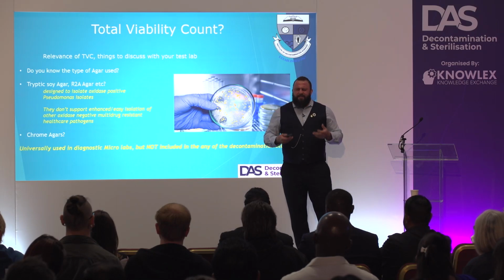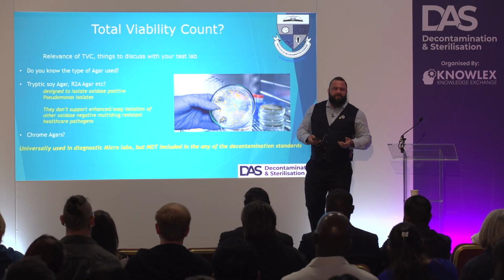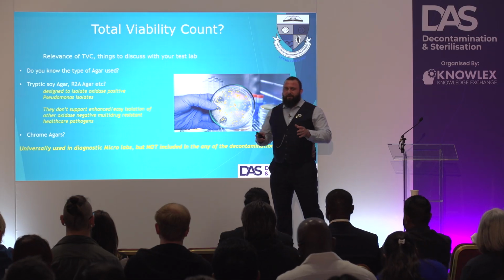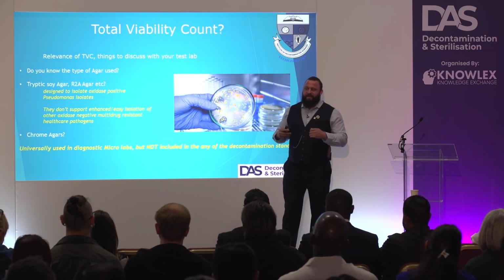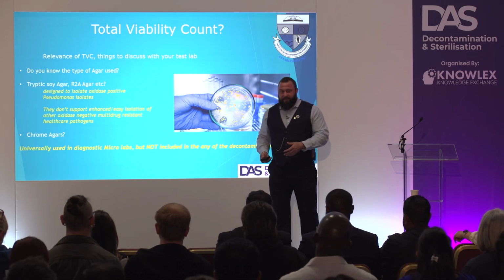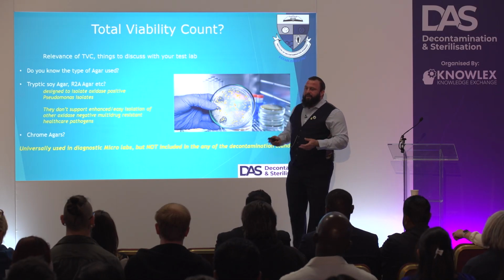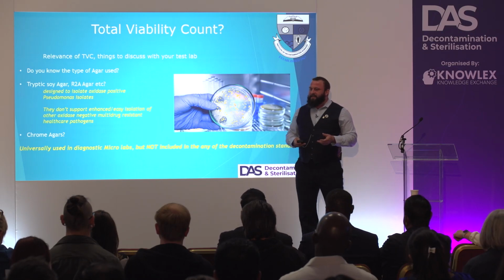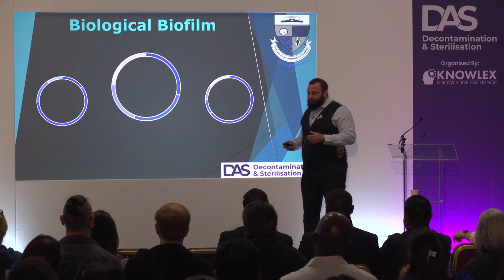So it's just something to think about and have those conversations with your test labs. Maybe you want to go down that route, or like a lot of places, ignorance is bliss, and what we don't know doesn't hurt us. When you start doing these things, you realise that there are a lot more risks within the endoscopes, and you start questioning whether the current practices for decontamination are suitable.